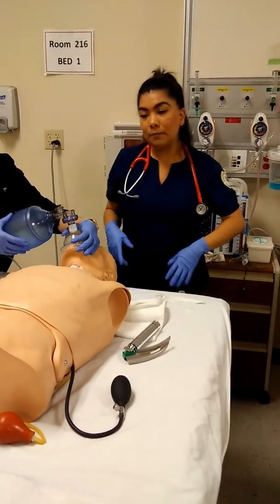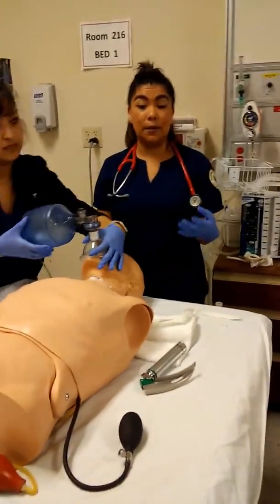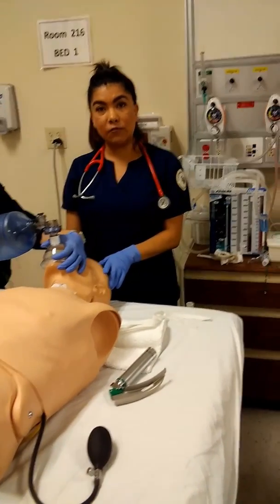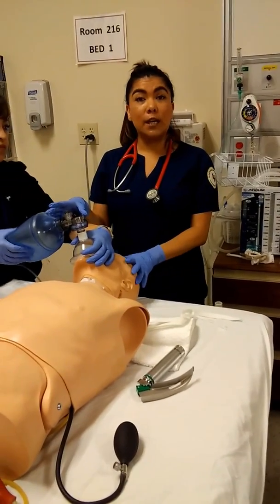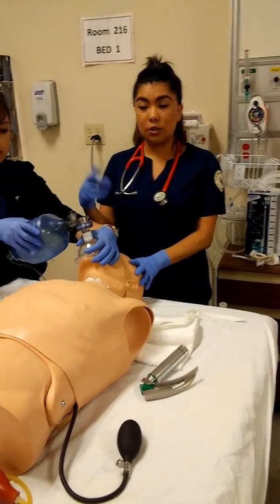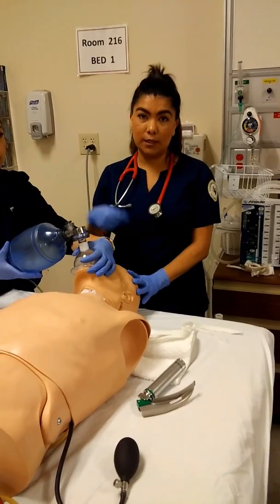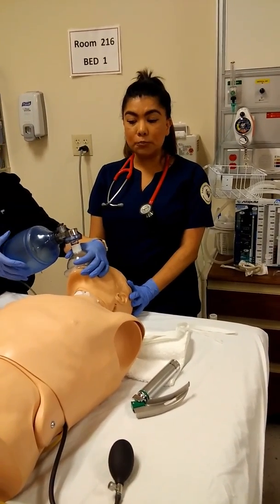And when intubating, you only have a maximum of 30 seconds to attempt to insert the tube. If you are unsuccessful, then you stop, you remove the tube, you oxygenate the patient again and provide them with 100% oxygen until they maintain 100%. Okay, and then you attempt again. You only have 30 seconds to do this procedure.